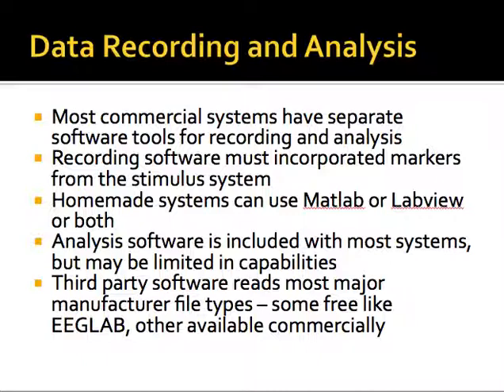There are homemade systems that use MATLAB and LabVIEW or both. The problem with a lot of analysis software is that there are two problems. One is it's fairly limited in capabilities. So you may get some very basic power density maps. A lot of systems now actually do some coherence and connectivity.